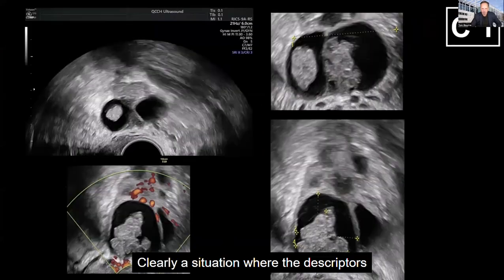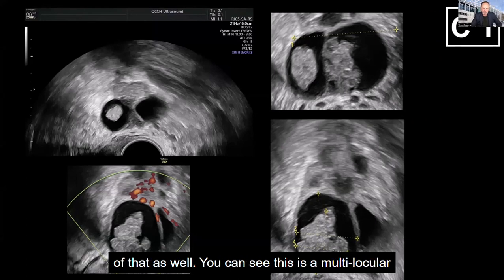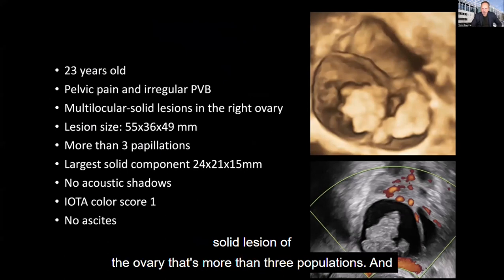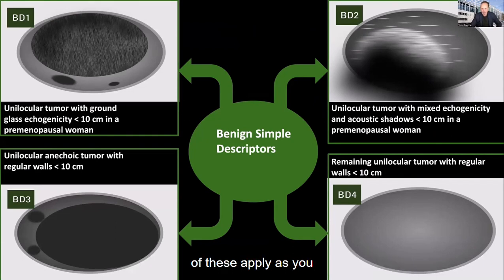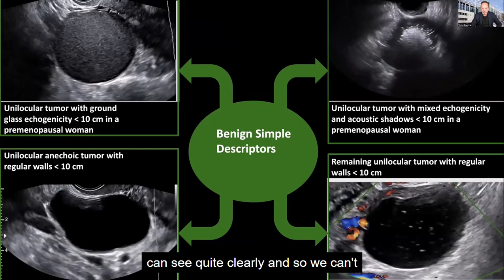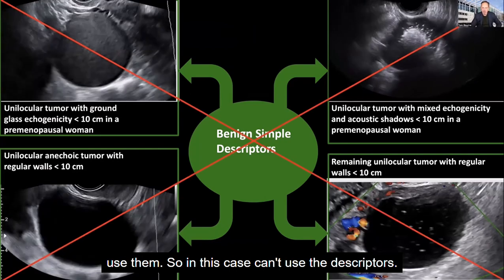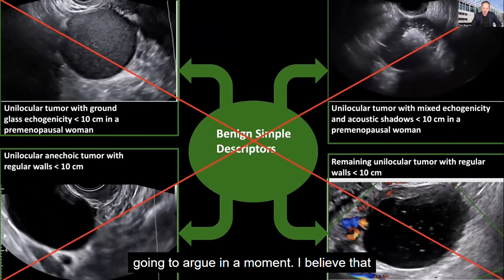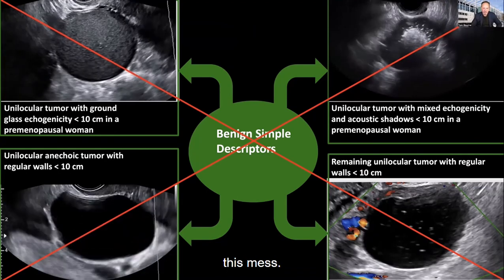Clearly, a situation where the descriptors are not going to apply, I think it's important to show an example of that as well. You can see this is a multilocular solid lesion of the ovary. There's more than 3 papillations, and if you start trying to apply benign descriptors, none of these apply, as you can see quite clearly, and so we can't use them. So in this case, we need to use something else, and as Dirk is going to argue in a moment, I believe that you should use the IOTA ADNEX model to classify this mass.